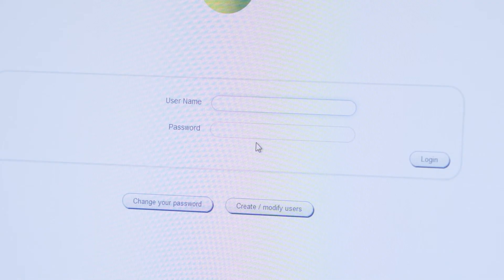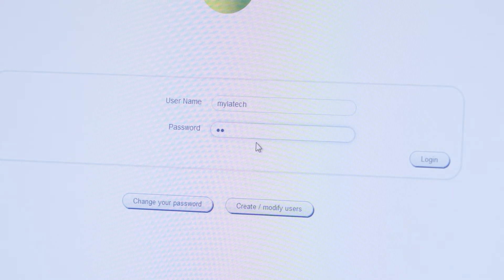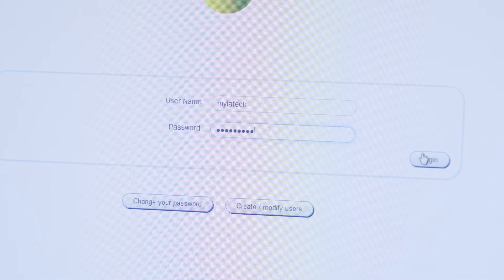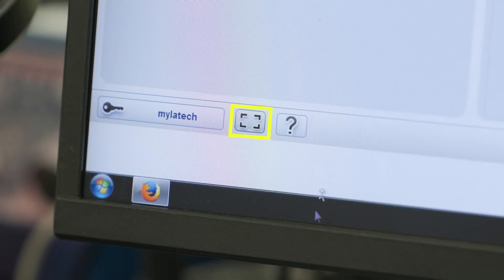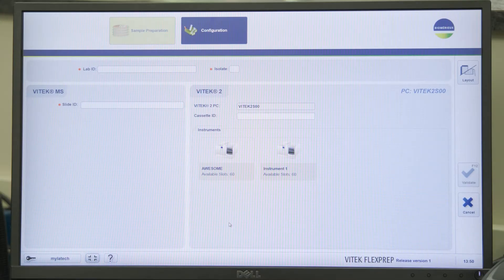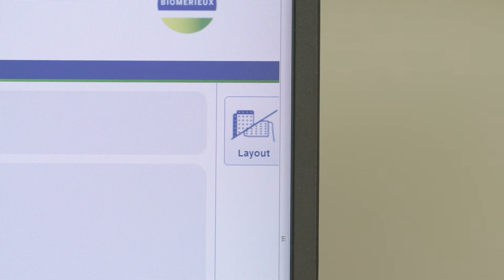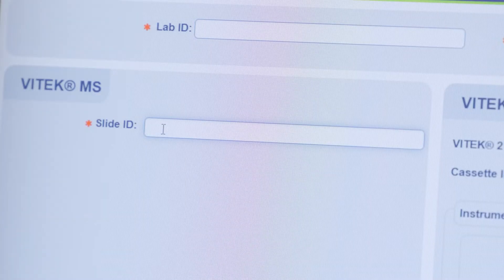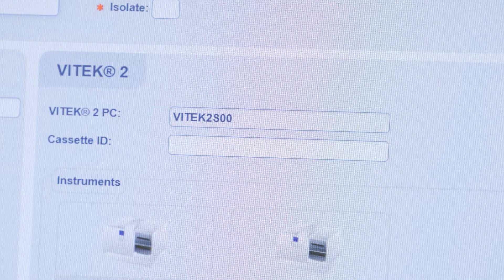Log in using a username belonging to the Vitec MS Prime or Vitec MS and Vitec 2 user groups. Click on the full screen icon to optimize view of the screen. From the sample preparation screen, click on the layout icon to display both Vitec MS and Vitec 2.